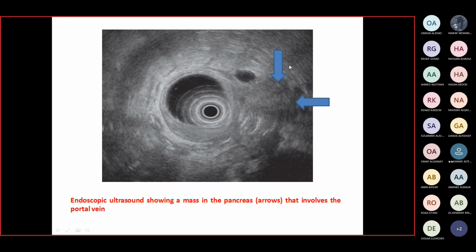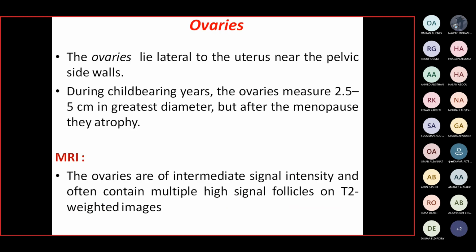You should know that this is an endoscopic ultrasound. There is a mass here, but you have to know this is endoscopic ultrasound, where an endoscope is inserted through the mouth, which contains a probe to look at the pancreas.